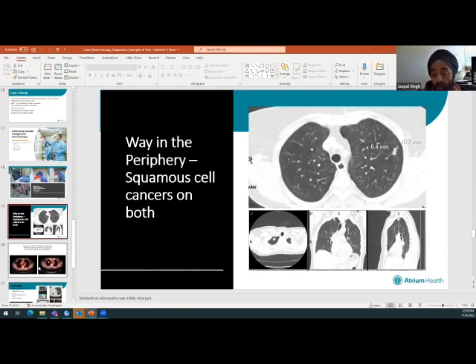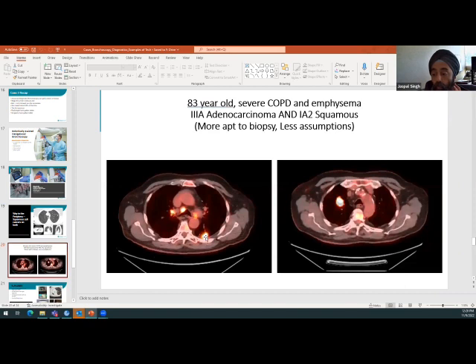So these are lesions that we're doing these days. Way on the periphery here, but at the same time, while we're there, we're already in the airway. Can we also biopsy these other little yellow spots? And in fact, this patient had two spots, one in the right lung, one in the left lung, and different lymph nodes. And sure enough, there were a couple of different cancers here in a single patient. So in a single procedure, we can actually diagnose multiple lesions safely.